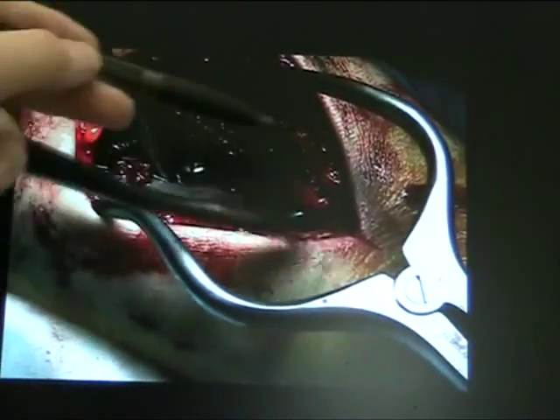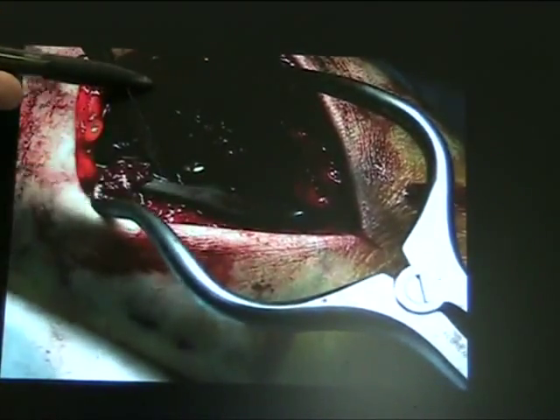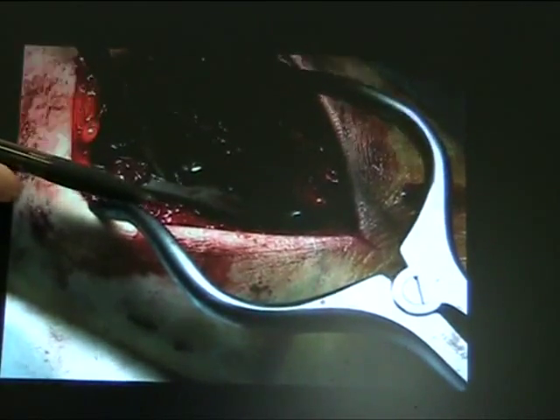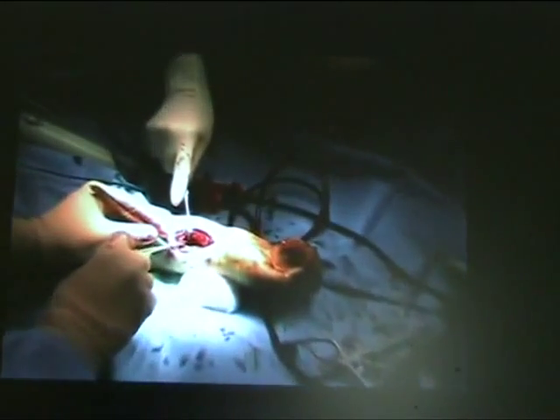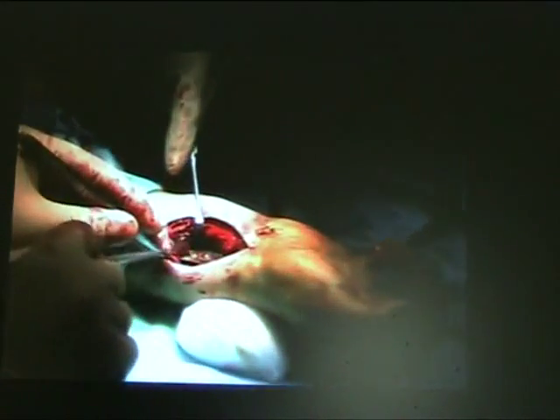Radial nerve and artery here. FCR is our guide to the incision. Pronator quadratus has been lifted. It's in position — all the screws have been locked down. So final check with the I.I. or x-ray.